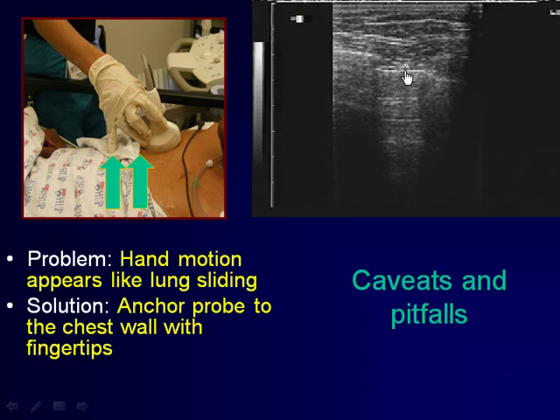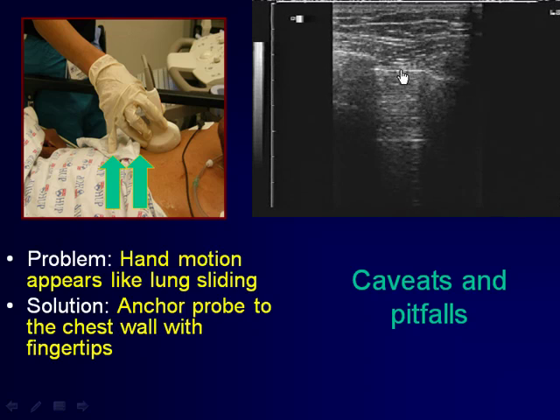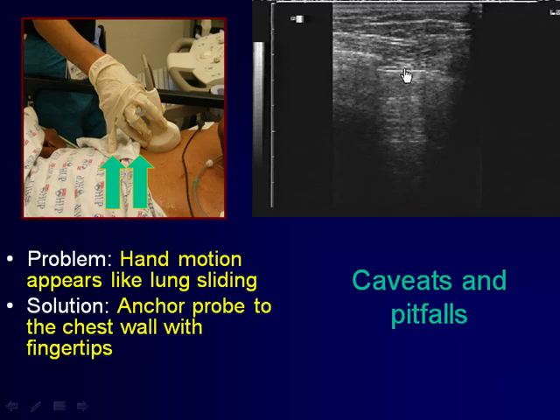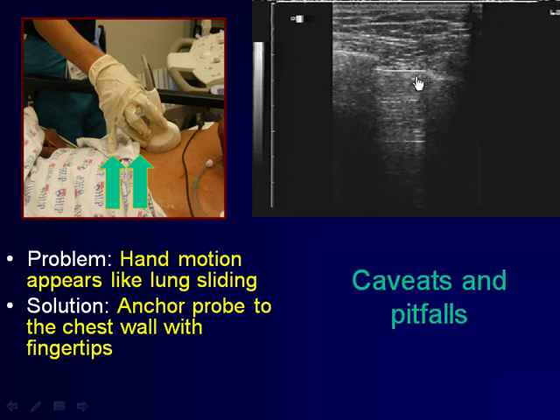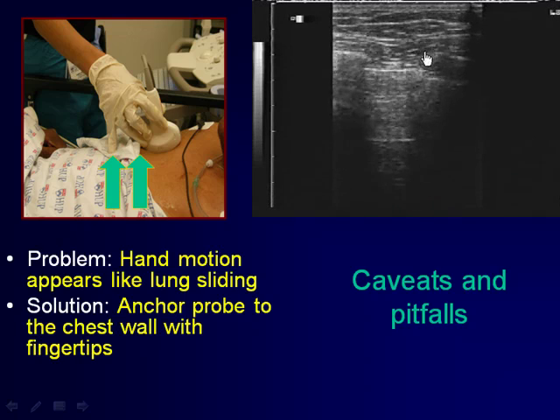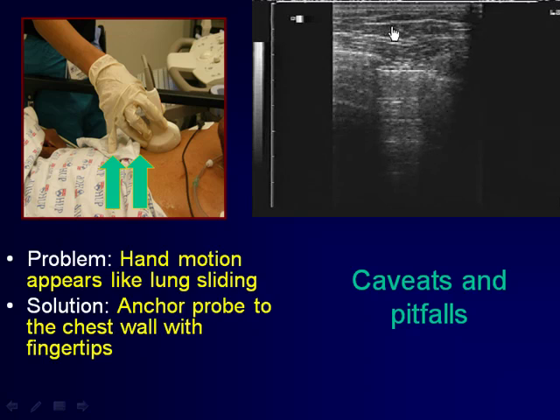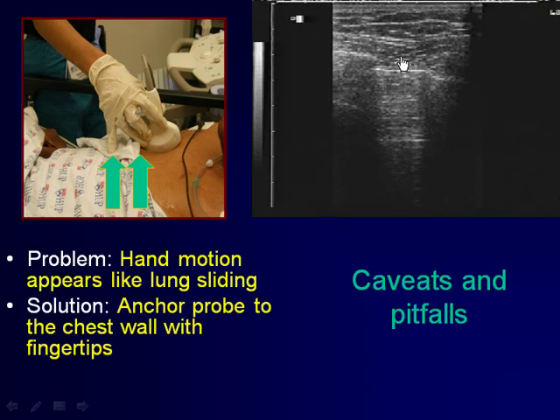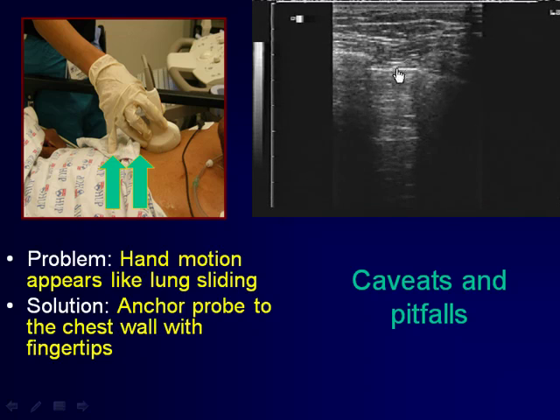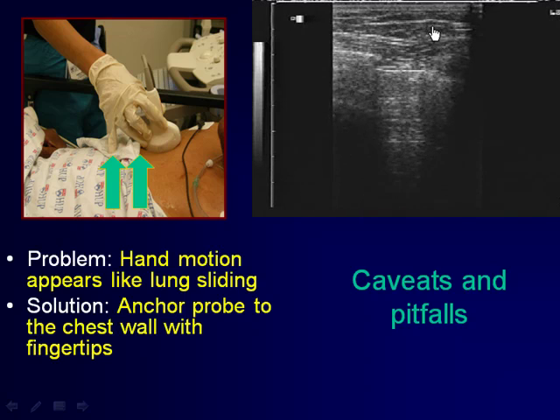This is actually a person with a pneumothorax, in the case we've seen previously. But the apparent motion of this every now and then is actually accompanied always by motion up in this area here, so that this is actually artifactual motion here. There is no lung sliding, and this is actually a pneumothorax. But if the examiner had held the hand steadier and more carefully positioned on the chest with the hand stabilized as described over in this picture here, this pneumothorax would be much easier to appreciate.